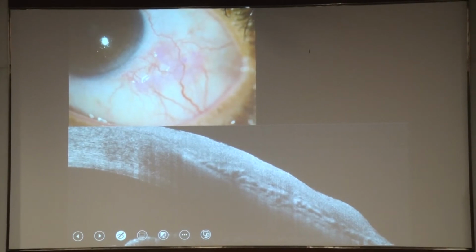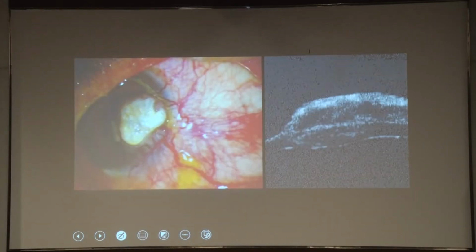This is a beautiful picture where you can actually see the level of the lesion very clearly. You can see that conjunctiva is involved, this bubbly layer is the Tenon's. So your plane of dissection can just be there, episcleral. You don't have to do anything in terms of deeper dissection. So you know the plane of the tumor. And in this patient, there is full thickness corneal stromal involvement, which means that you have to either consider a penetrating keratoplasty or plaque brachytherapy.